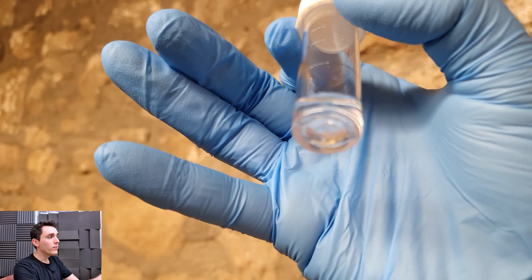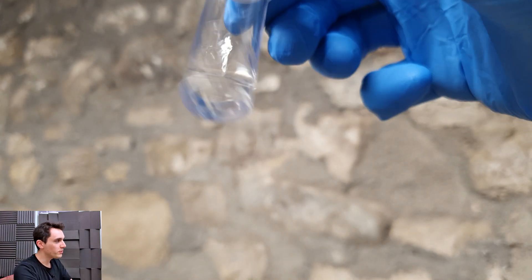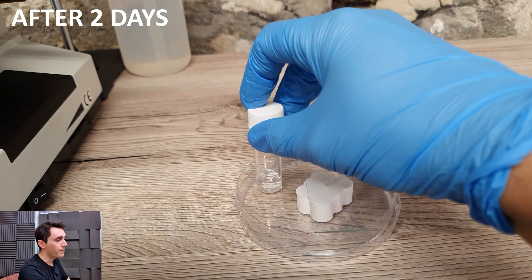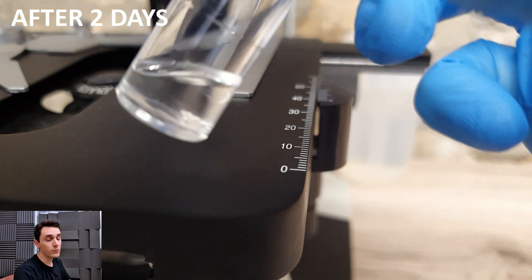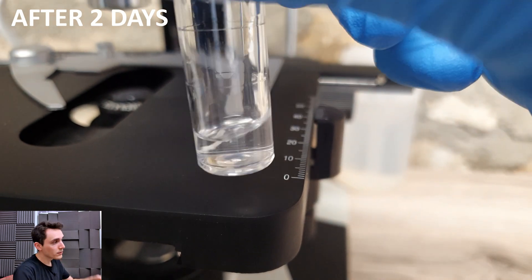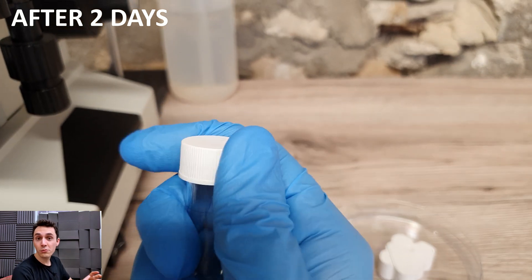What KOH does is it will lyse or dissolve skin. Normally a KOH test is for checking fungal infections. So if you've had a case of ringworm or a suspected fungal infection somewhere on your body, your doctor might take skin scrapings with a dull scalpel. Those scrapings go onto a microscope slide with potassium hydroxide, and after some time it will dissolve all of the skin, but the fungal cells will remain.